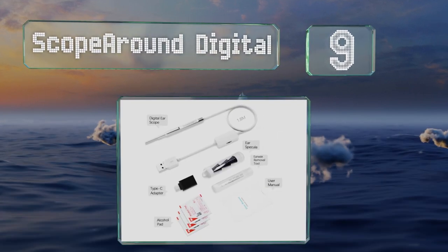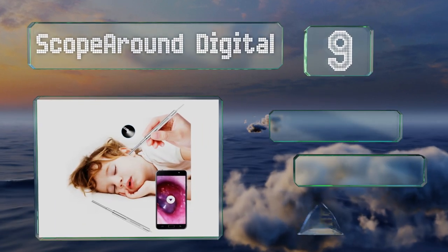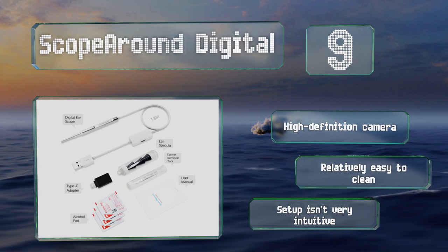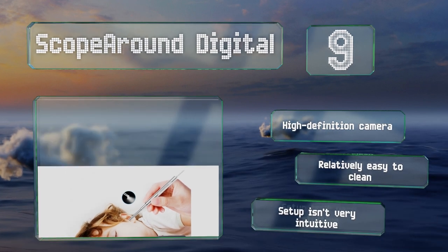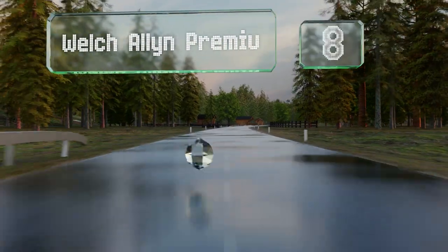At number nine, with a diameter of less than four millimeters, the Scope Around Digital can reach deep inside human and canine ear canals to help diagnose infections and remove wax buildup. Although it works with Android devices, it isn't compatible with the Apple iPad or iPhone. It's equipped with a high definition camera and is relatively easy to clean, but setup isn't very intuitive.